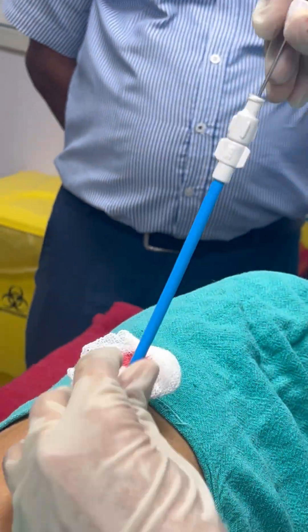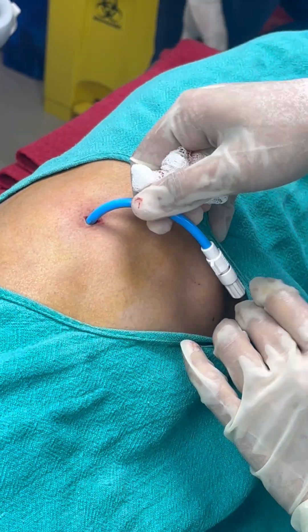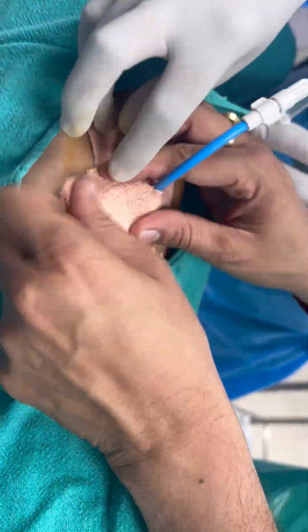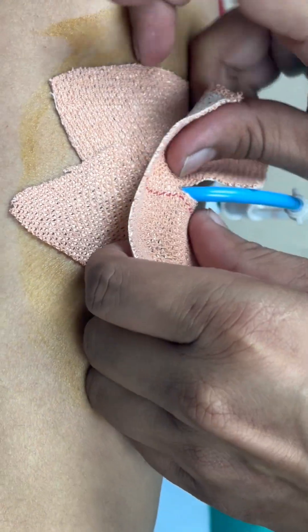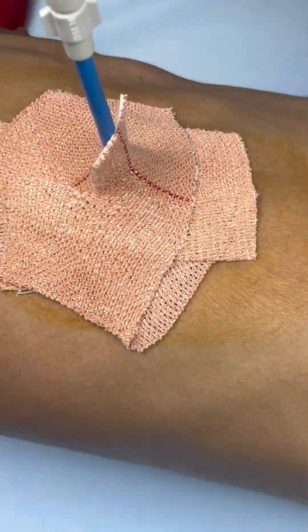Once you insert in the pleura, remove the outer cap, then the inner cap. Insert the pigtail and suck out the fluid. Fix the pigtail with dynoplast from both sides — no need to give a suture.